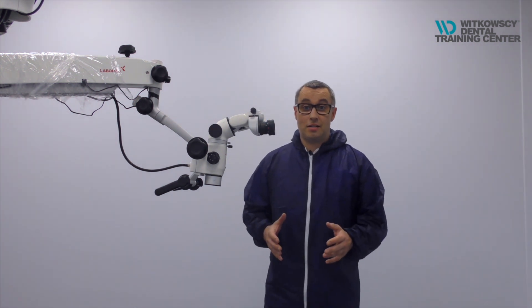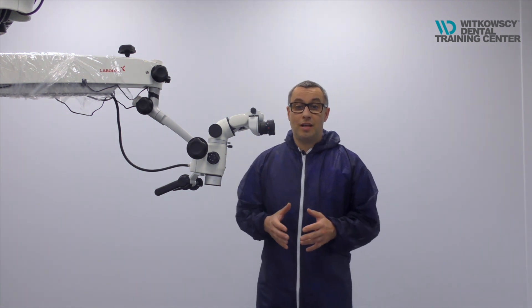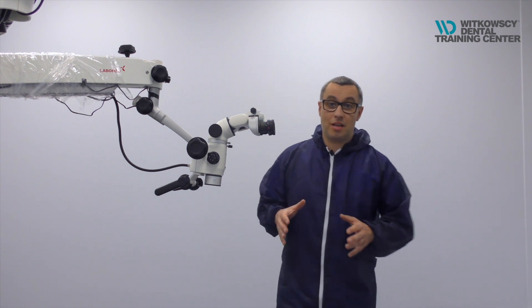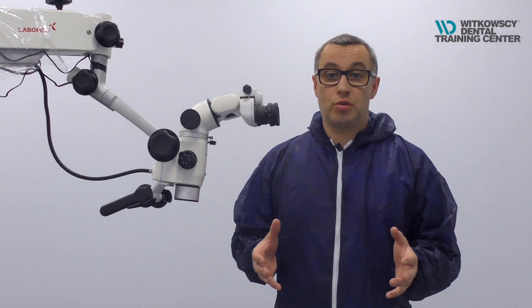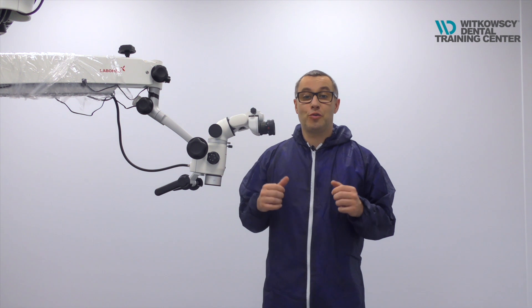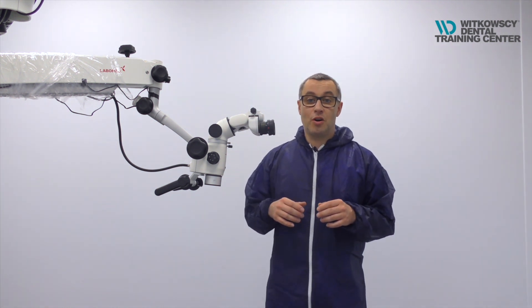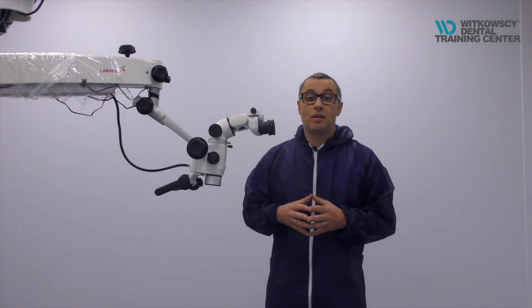Now we are in the office and the question is how to prepare your microscope in order to start working properly in pandemic times. We are really afraid about the spray, the moisture that is coming out from our turbines, from our micromotors, and we should be afraid about this. But there is a solution and I will show you how to work safely using your microscope for normal endodontic treatment, prosthodontic preparation, or aesthetic dentistry.